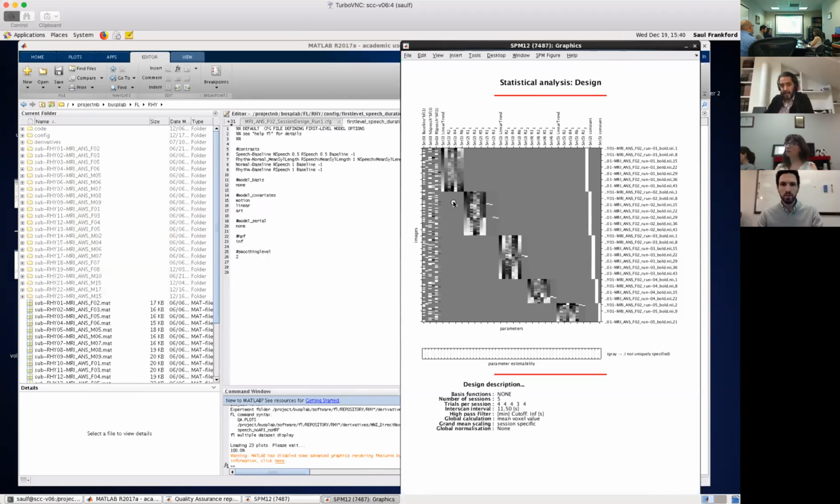When estimating the condition A effect and the condition B effect, the model does so knowing that some portion of the BOLD signal correlates with the duration of the individual events in condition A, and some portion of the BOLD signal variability covaries with the duration in condition B, right? Makes sense? So just by having the P1 in that session design file.